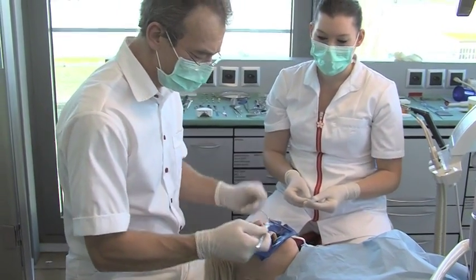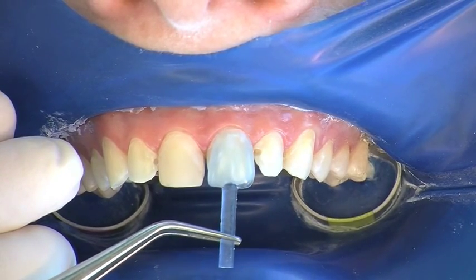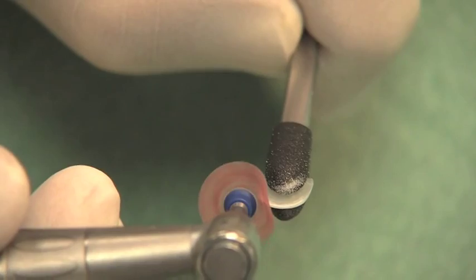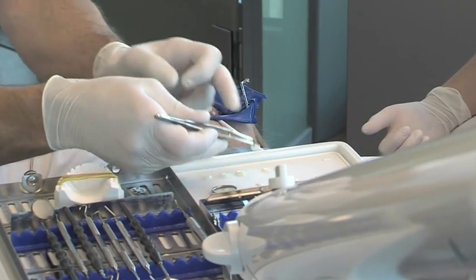Shape and size are rechecked after preparation before the Componeer is removed from its packaging. Shapes are corrected if necessary by using a low-RPM disc operated in a dry oral environment. The Componeer holder provides a perfect hold for this procedure.